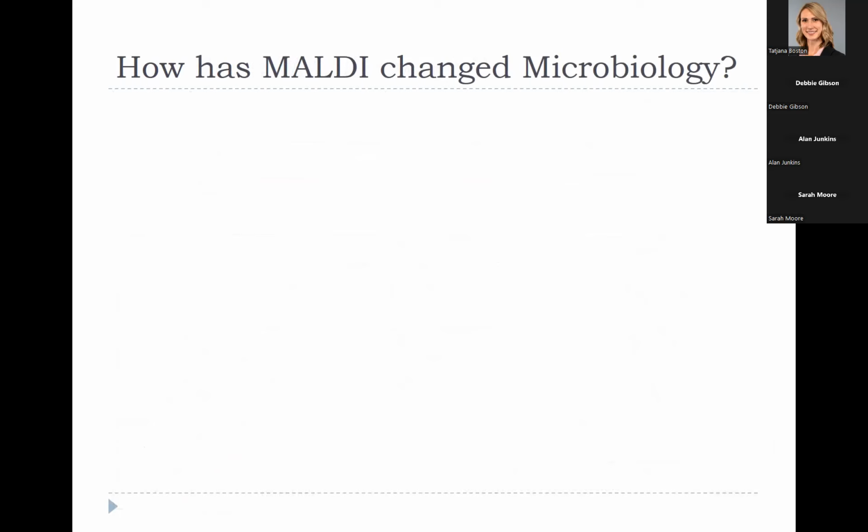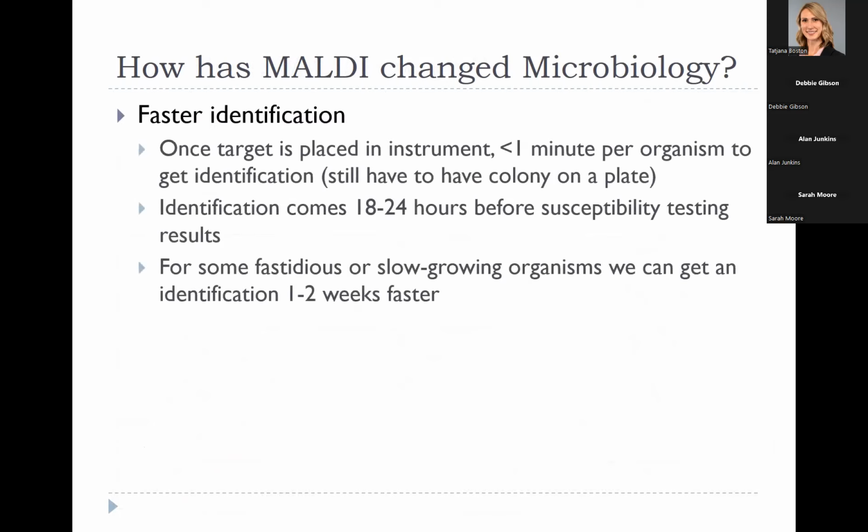How has MALDI changed microbiology? Obviously, this was a huge revolution in how we went about identifying organisms. And it works, all I can say is it works fantastic. It's our favorite toy.